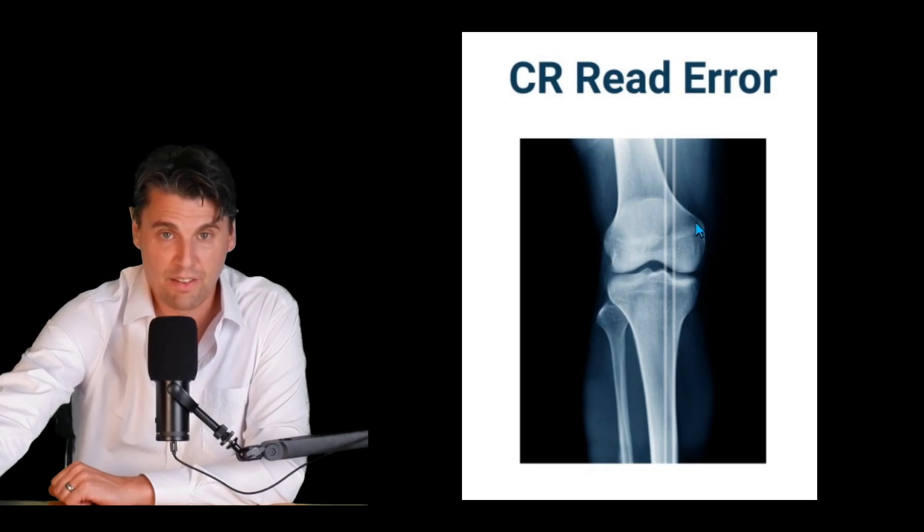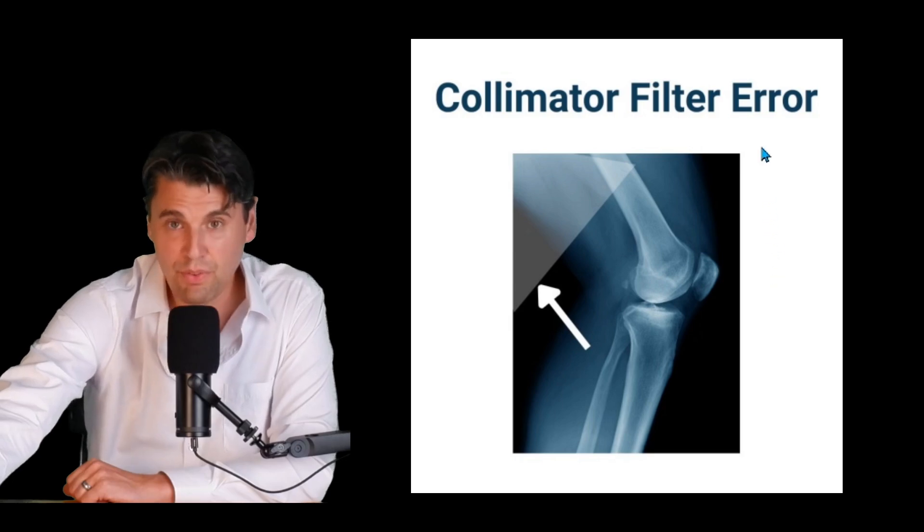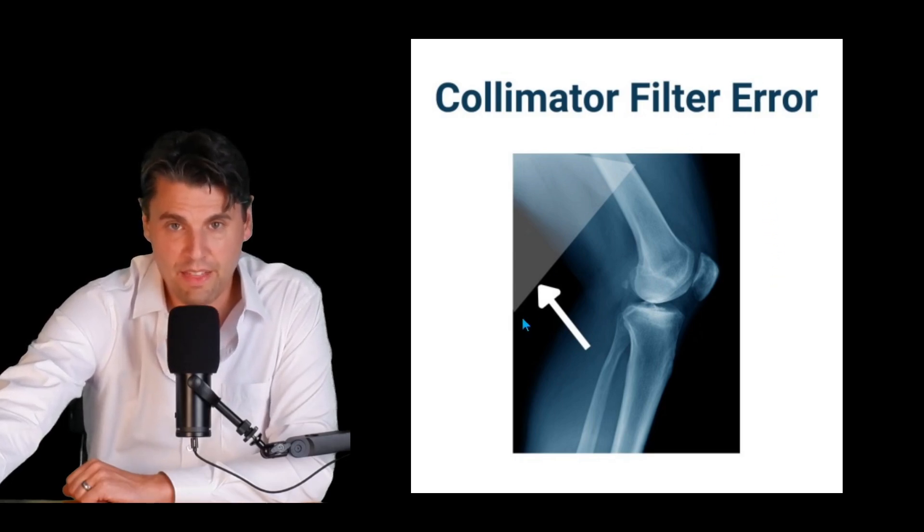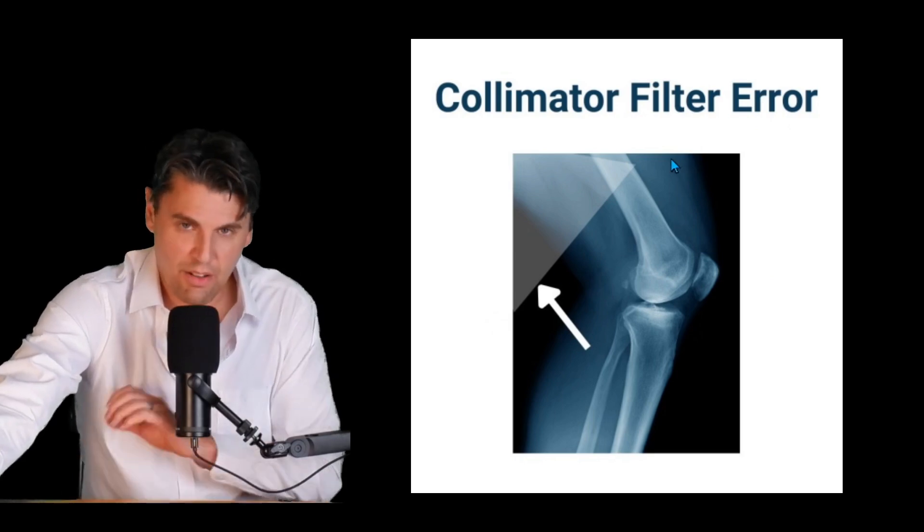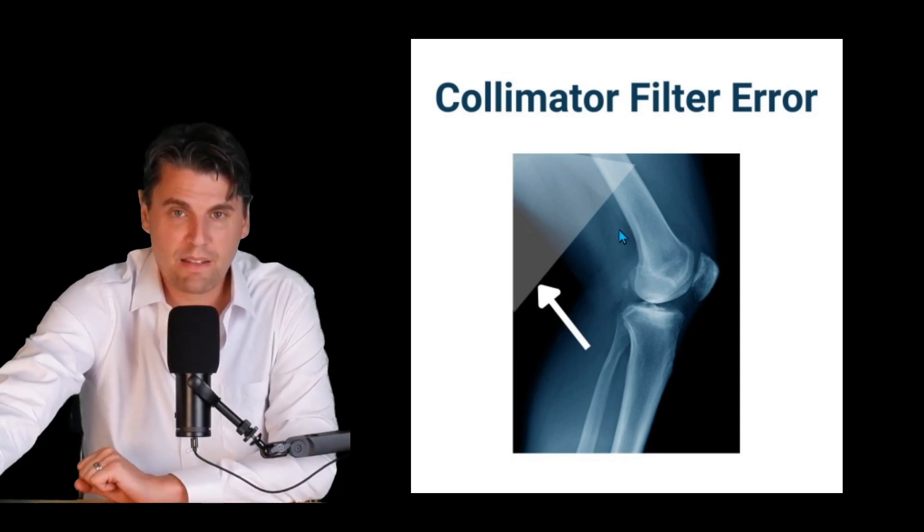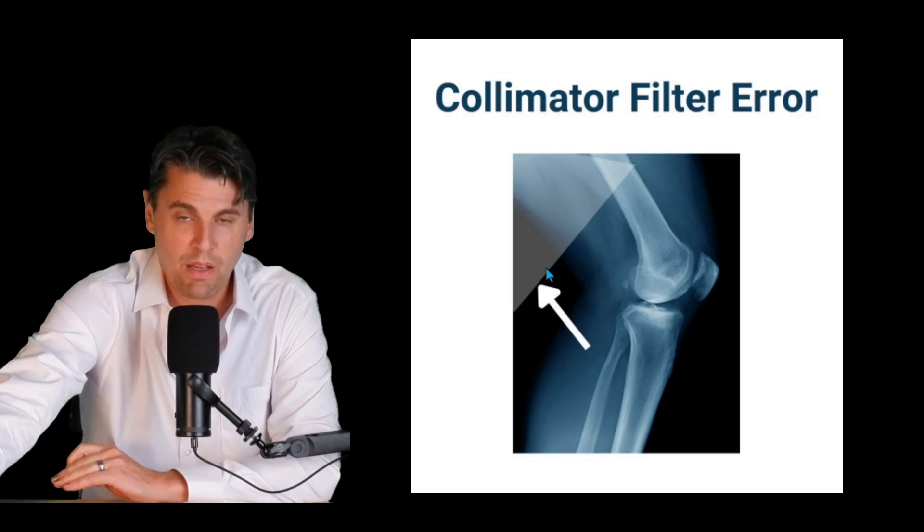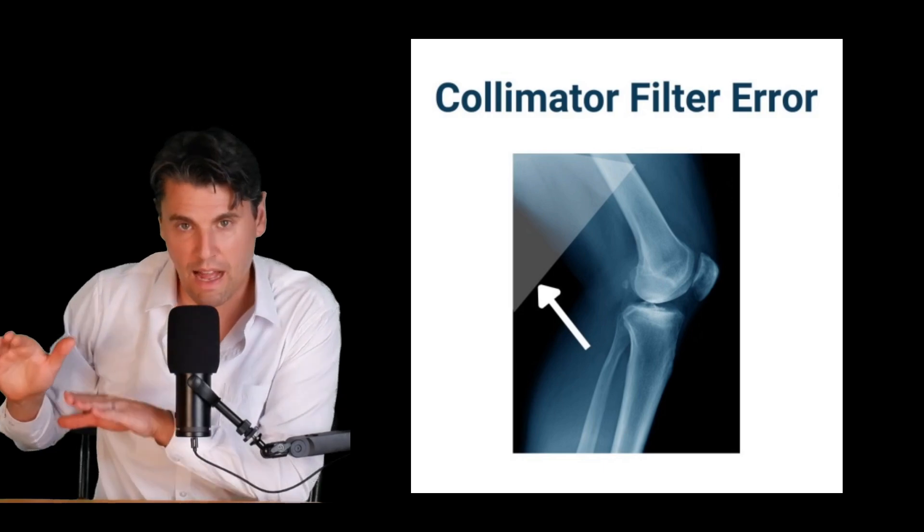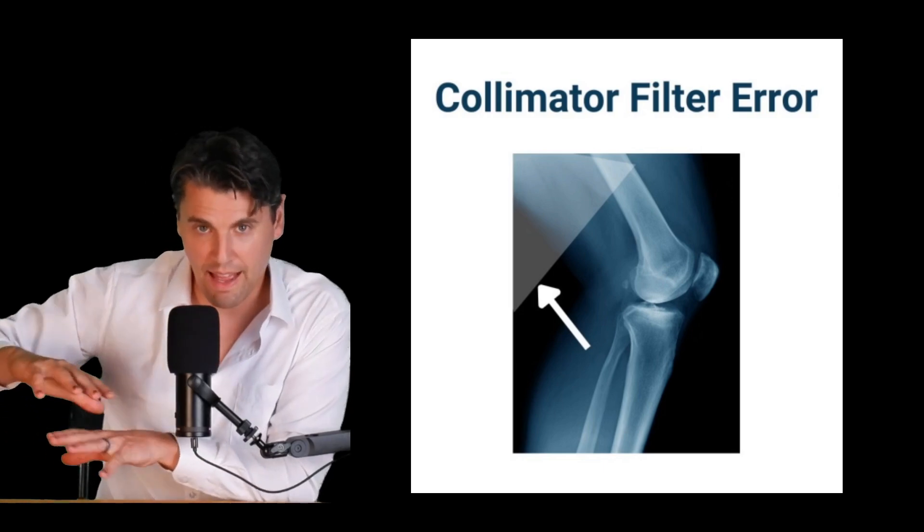If you see something like this where you have a structure either a rectangular structure or triangular structure one possibility on an x-ray system is that is actually due to part of the collimator assembly that has come loose.